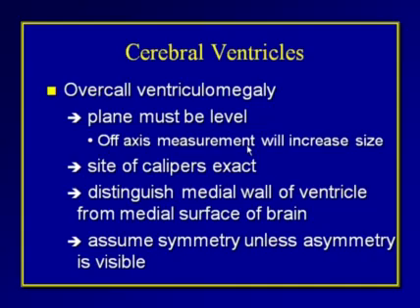It's important when looking at the fetal head to spend some time looking at the lateral ventricles and not to overcall ventriculomegaly. The plane of imaging to measure a lateral ventricle must be level. Any off-axis measurement will increase the size of the ventricle. It's important to put the calipers exactly where the edge of the lateral ventricle is, just on the inside of the ventricular lining, and be careful not to measure the medial surface of the brain rather than the medial wall of the ventricle.